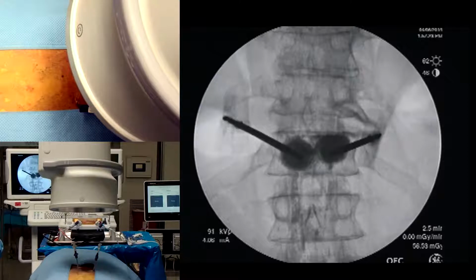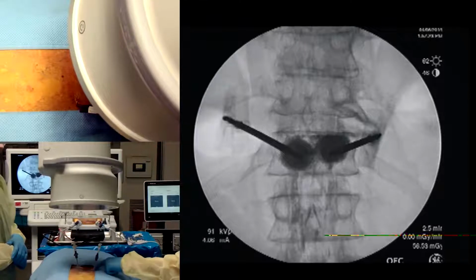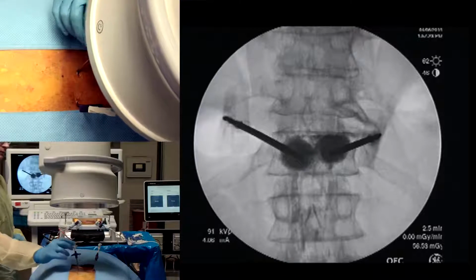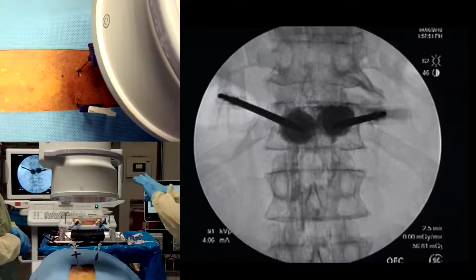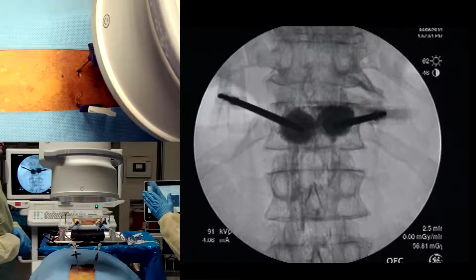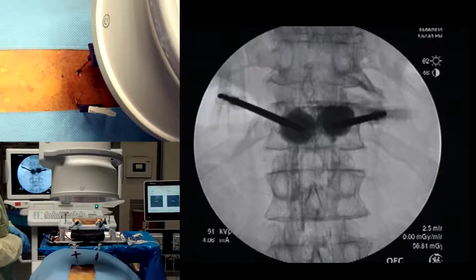So as we wait for this to harden, do we have another set to work on the vertebroplasty? Okay. So we'll go down to L1, so come down just south about another inch or so. And then whenever we're ready, we'll get the trochars. Yeah. But that fill on that AP is really good. I like that. That fill looks really good. You know, I filled my half, you filled your half. On the lateral view, we're a little bit more anterior, just slightly more anterior. Yeah. It's got good filling characteristics.